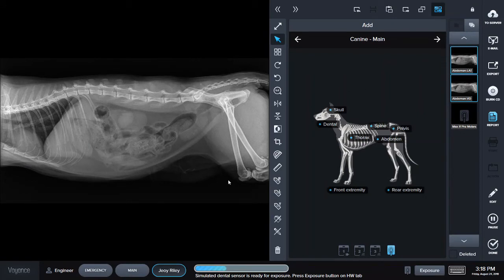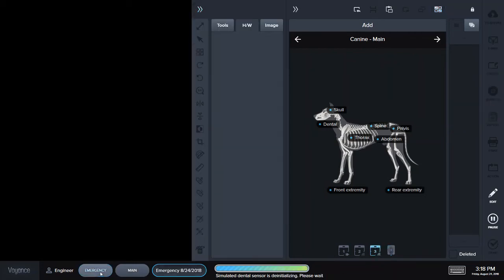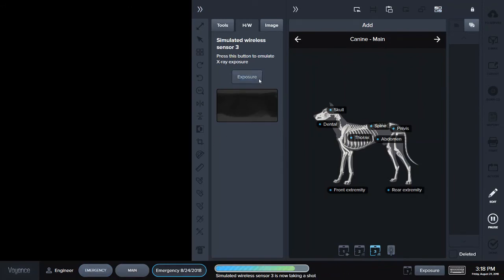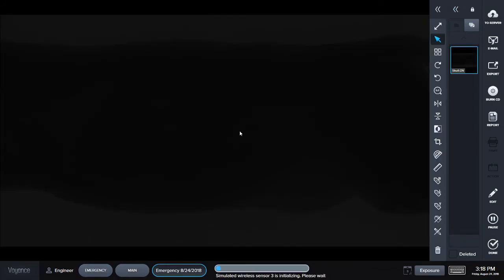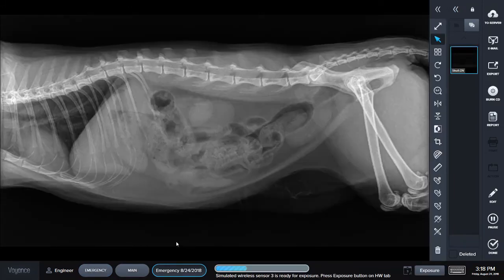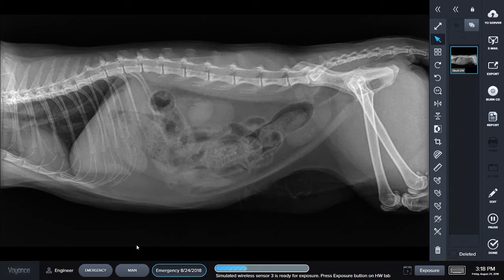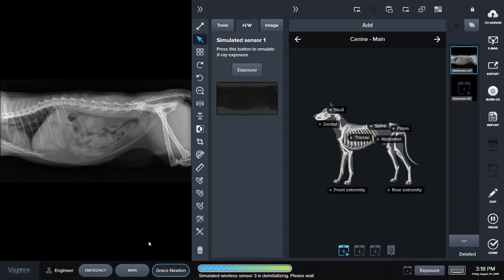If I'm working on this patient and I have an emergency come in, I can open emergency here at the bottom and take a quick x-ray. Then I can easily go back to the last patient with one click. Down here I have all of my open studies and I can toggle between them without having to close or save anything.